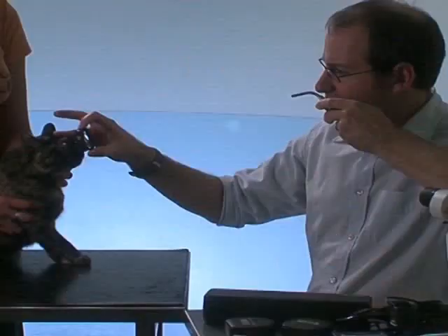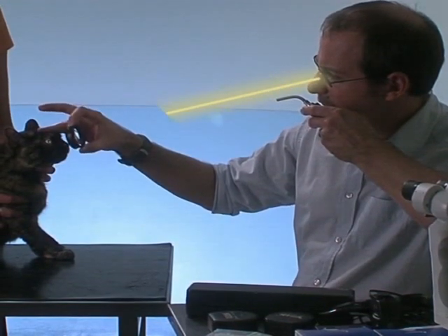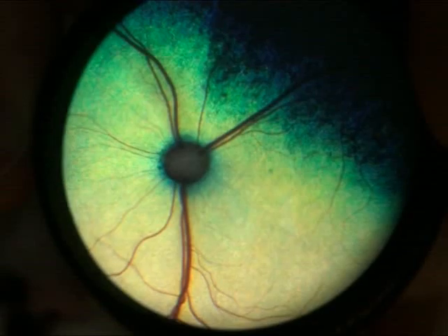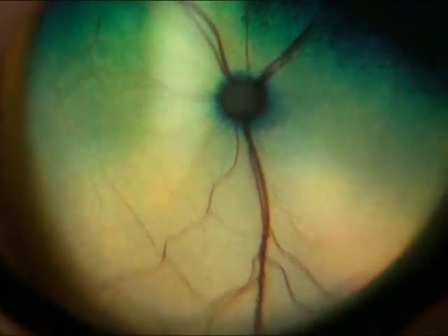If a handheld light source is used, it should be held near the examiner's head, as close as possible to the axis connecting the examiner's eye, the handheld lens, and the animal's pupil. Note that the image is back to front and upside down. Any changes should be noted as they appear, and their location interpreted later.